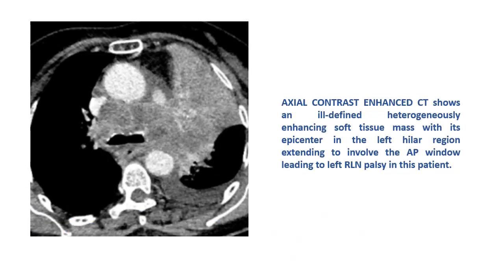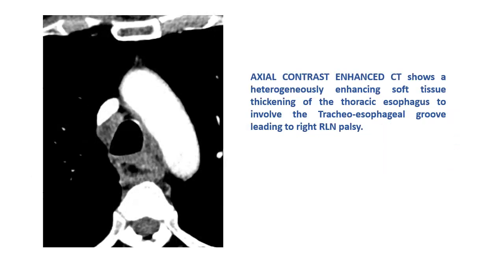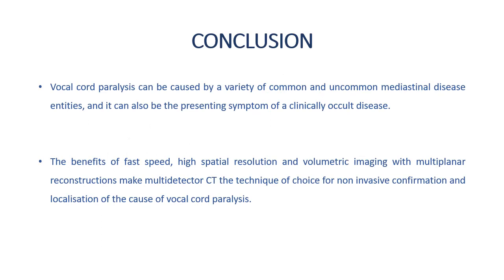The axial contrast-enhanced CT shows an ill-defined heterogeneously enhancing soft tissue mass with its epicenter in the left hilar region extending to involve the AP window, leading to a left recurrent laryngeal nerve palsy in this patient. Another axial contrast-enhanced CT shows heterogeneously enhancing soft tissue thickening of the thoracic esophagus involving the tracheoesophageal groove, leading to a right recurrent laryngeal nerve palsy.